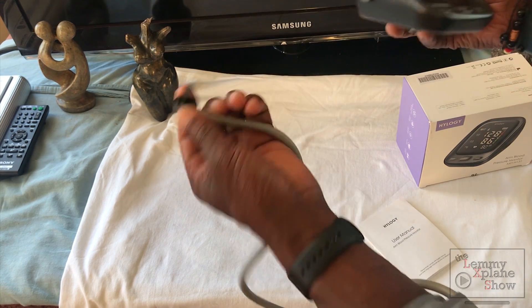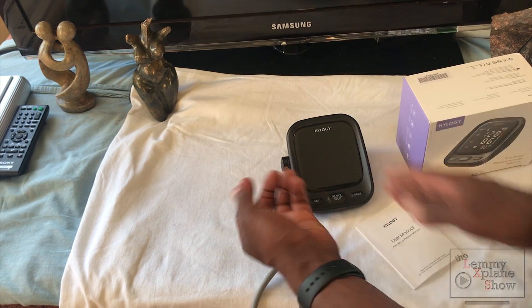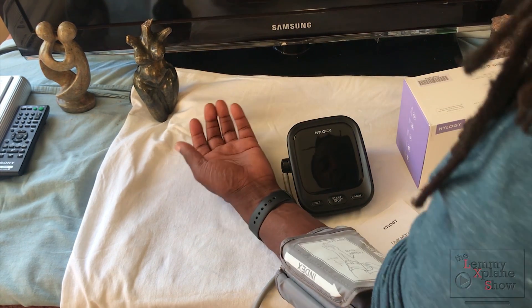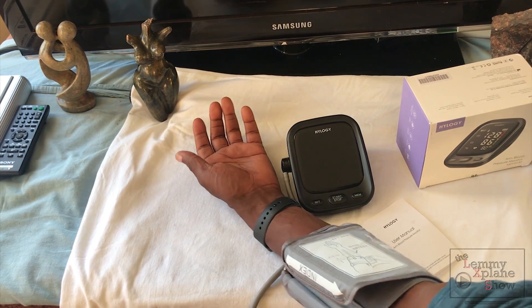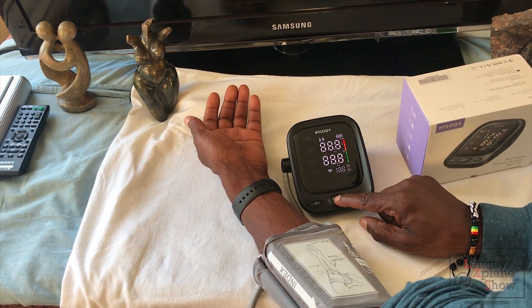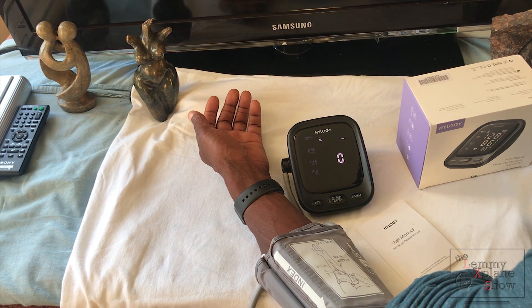I've already plugged this in — this part plugs into this hole. This is your pump. Rest your arm and then press start.